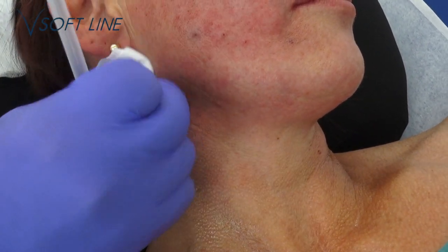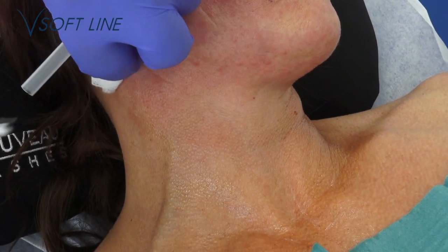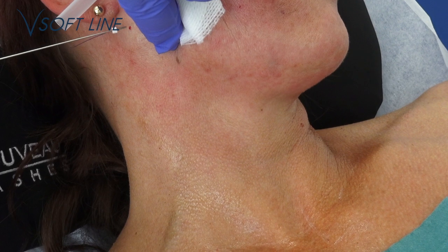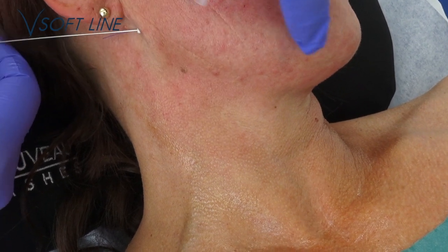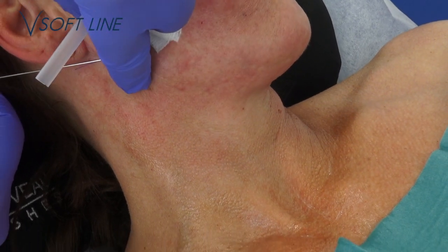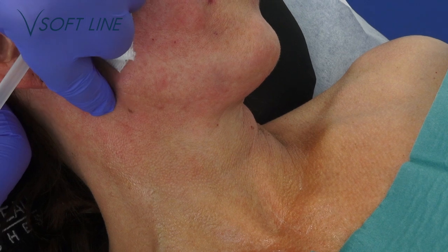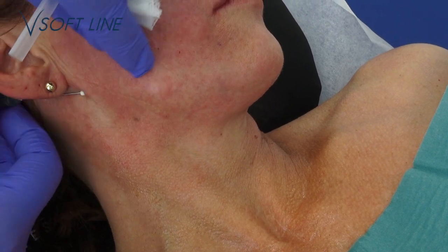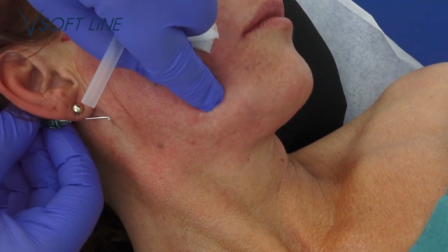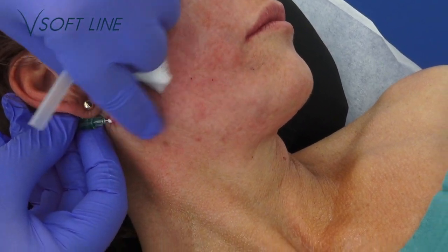Here I will use 21G. You may choose either blunt cannula or sharp needle, though I recommend nothing coarser than 21G. In parallel with the jawline, use your fingers as a support, putting firm pressure on the cannula. It is important not to go too deep. That may result in a weaker lifting effect.